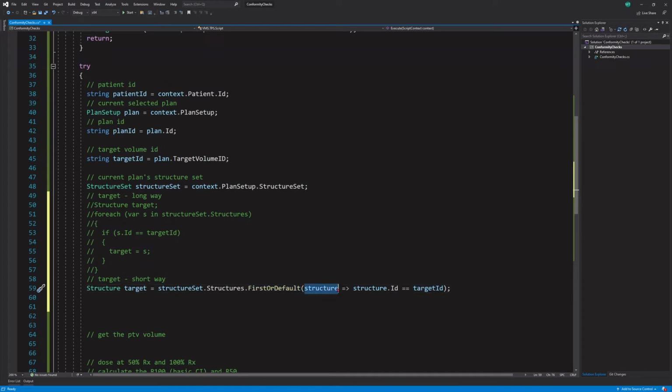And then the reason that I wrote X is because usually you'll see something like this, or maybe you'll see O for object. So you've created an anonymous parameter, and then you're just accessing it. A lot of times, especially physicists or people that like math, they'll just use X. But you could use S. Sometimes I'll use whatever letter I would have; up here you can see I used S, because I'm looping through the structures, so S makes sense. But it really doesn't matter, as long as whatever parameter you declare, you use it here.